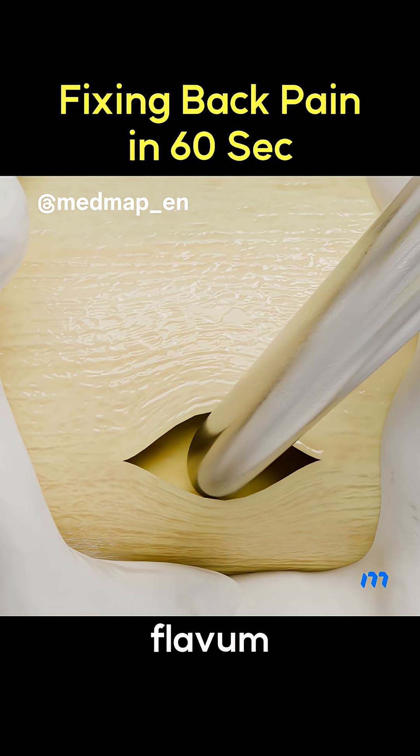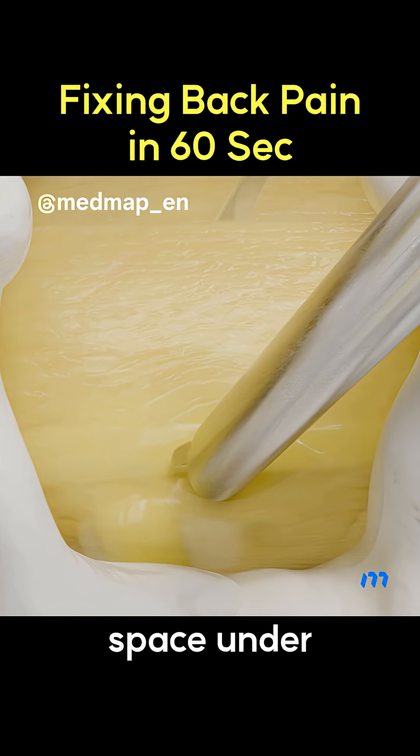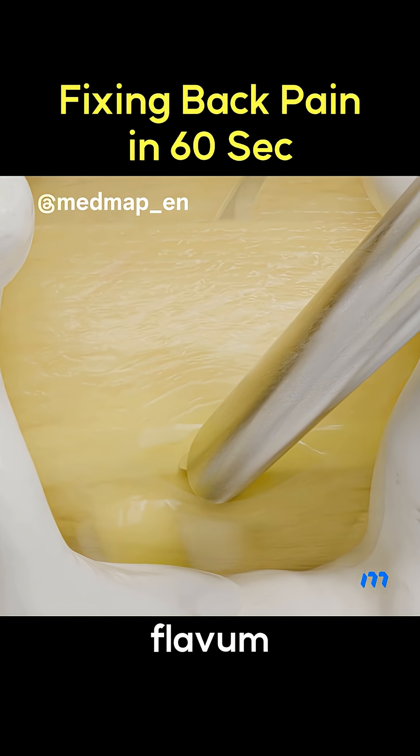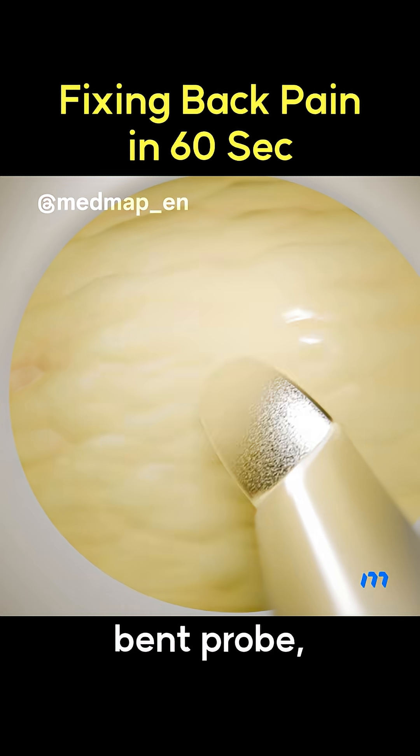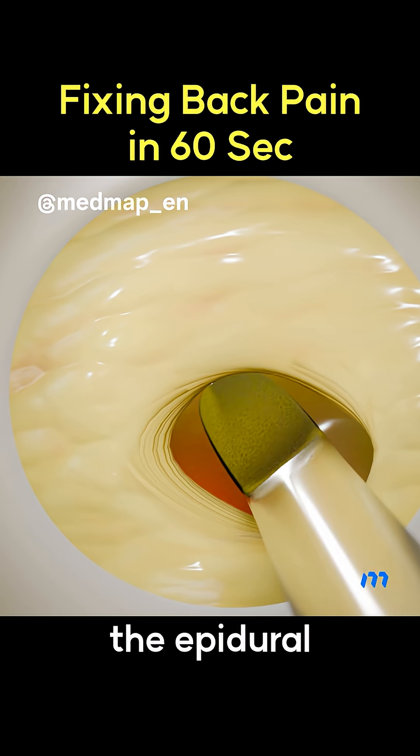After the ligamentum flavum is split, the working sleeve bevel enters the epidural space under endoscopic view. The ligamentum flavum is gently split with a bent probe, and the beveled sleeve is rotated to enter the epidural space.